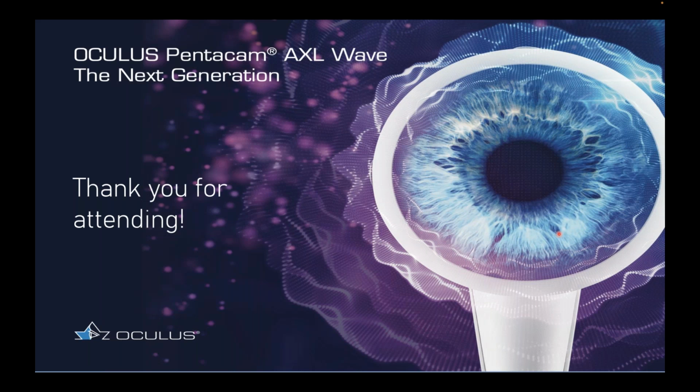And in my theory, it's the data from 6 to 9 millimeters, because we're fitting such larger lenses now to get that beautiful centration. I really think it's the data from the return zone outwards. We were extrapolating and guessing, and now we're not guessing at all. Yeah, I completely agree. When you know that data out there, you can create lenses that are toric or quad or freeform, and you can really hug that peripheral cornea, and that helps centration a lot.